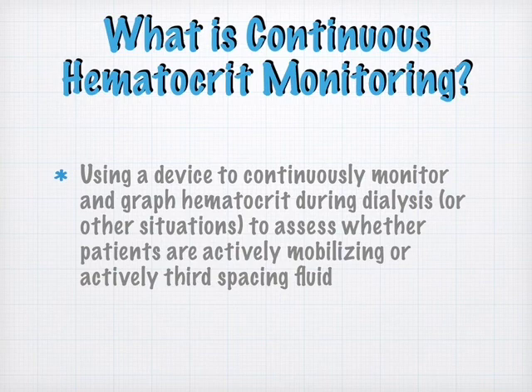who were post-ops, or they were going septic, or they had major surgery, or they were 5 days after surgery and they were terribly third spaced, and we didn't know whether or not we could get at the edema that they had, and we didn't know whether or not the patient was going to recruit the fluid if we tried to remove it. And the problem was that if we didn't understand that well, we could remove too much fluid and cause our patients a great deal of harm.